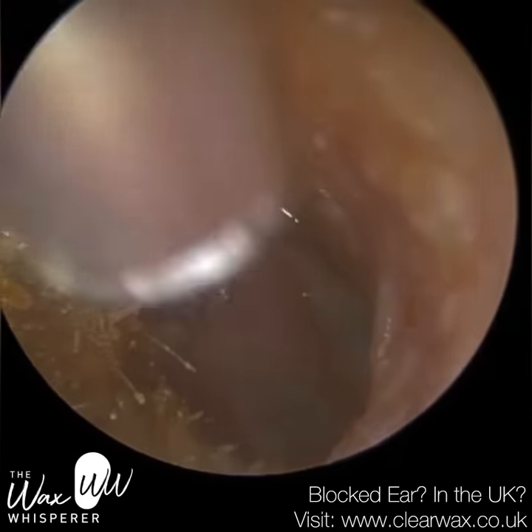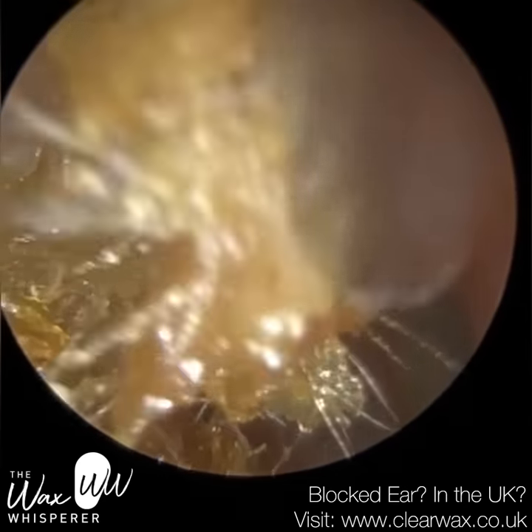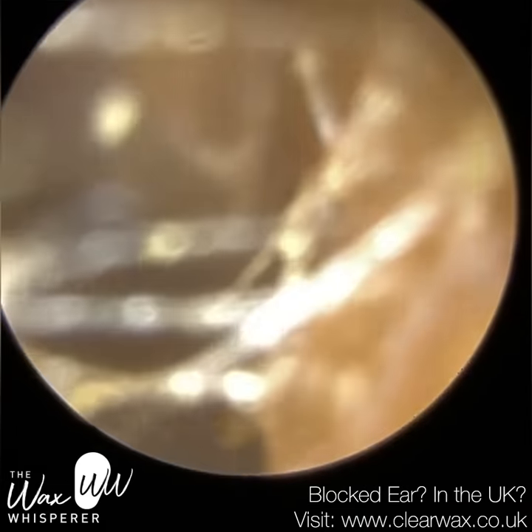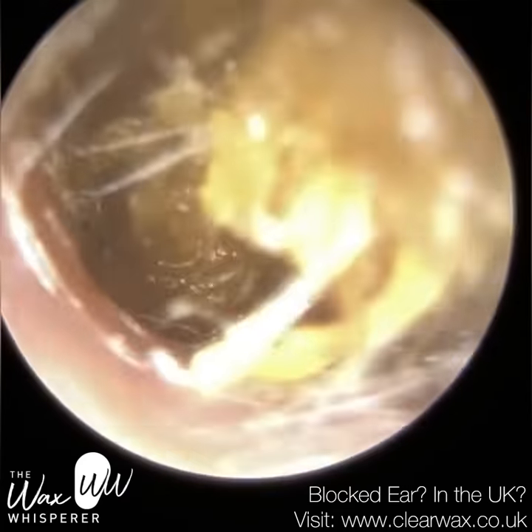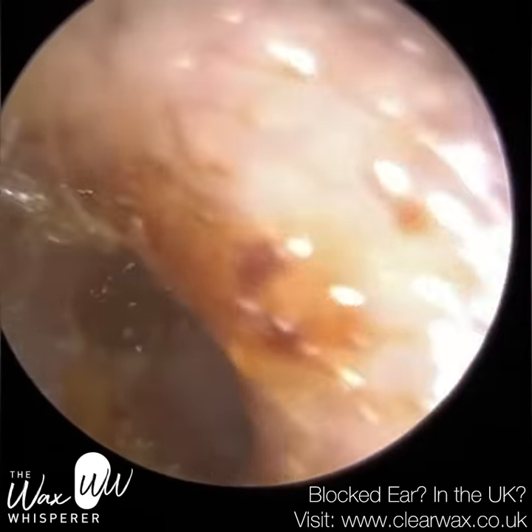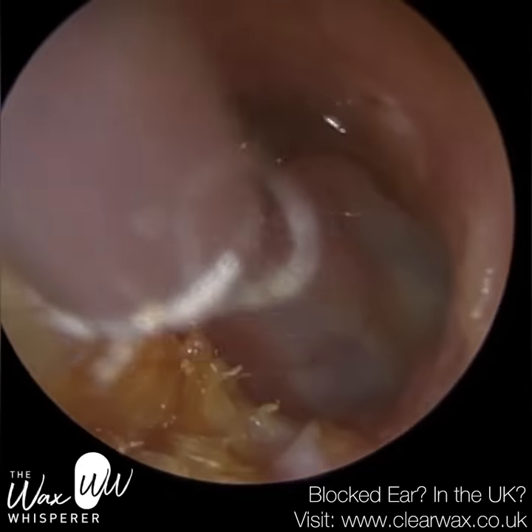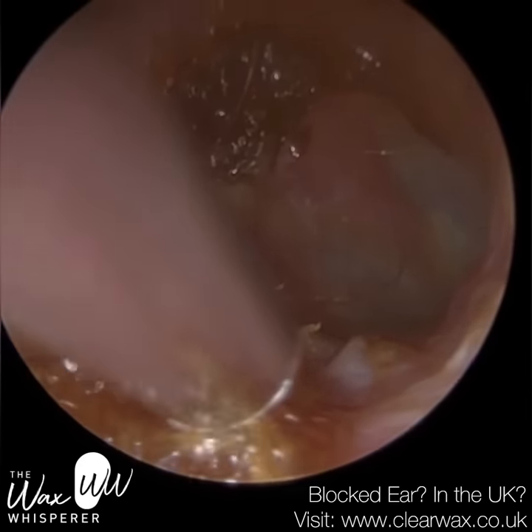So it's quite a severe impaction. You can actually see on the eardrum — you'll have a better view right at the end — but one of the blood capillaries is slightly dilated. I suspect that's because of the trauma the patient experienced when they were trying to use a cotton bud and also the shower head to flush out this wax. That will all settle down. The skin is slightly macerated — meaning it's softened because of the excessive water in the ear.